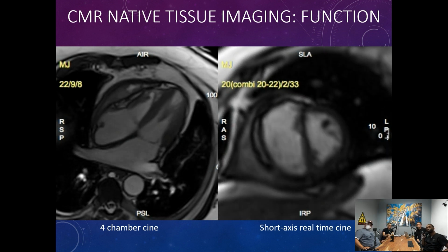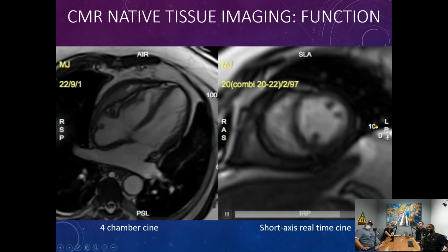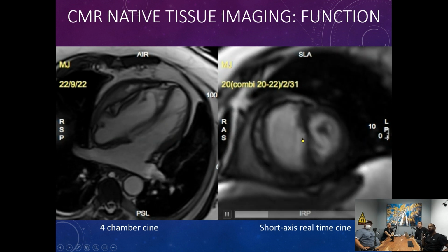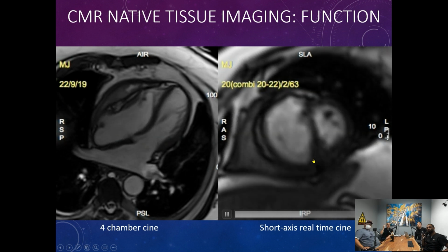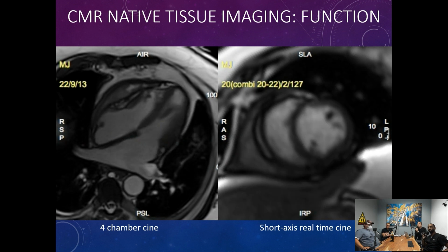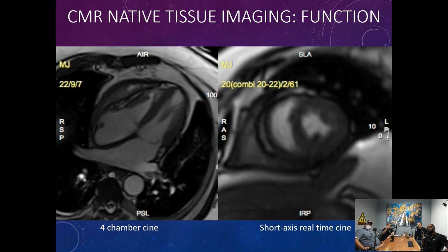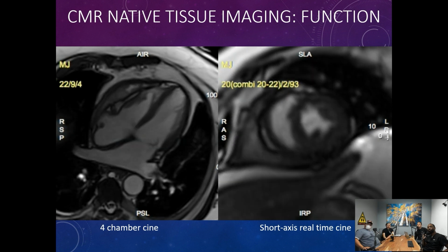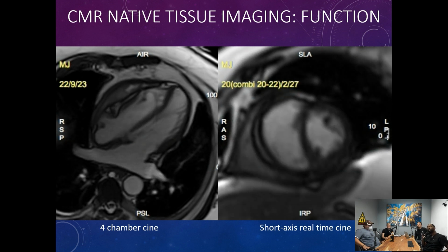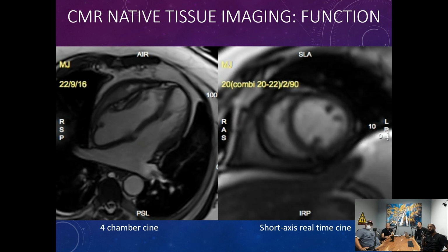But then what we can see here is when the patient breathes in, and how do we tell the patient's breathing in? Well, the heart goes down, the lungs inflate with air. As it's going down, you see flattening of the septum. So this is a clue that the patient has what we call constrictive pericarditis. It's one of those pericarditis that's squeezing the heart and making it difficult for the patient to breathe. Now, this patient actually had severe renal failure. So we did not inject gadolinium for safety reasons, but yet we were able to do a very nice exam in this dialysis patient with chronic constrictive pericarditis.